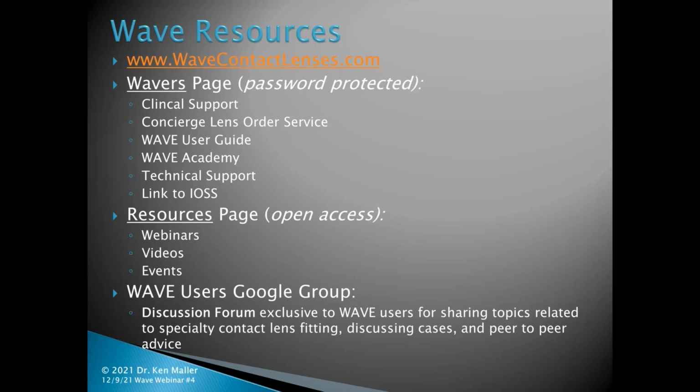If the thought process is, well, I'll just design a freeform for every cornea that I see, that typically leads wave users astray, and then they don't understand why they couldn't get the case successful. It just adds an unnecessary amount of complexity to a case, and troubleshooting can sometimes be absolutely impossible from that standpoint. So simplest that gets the job done is where you want to go.